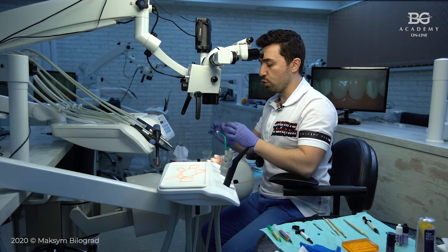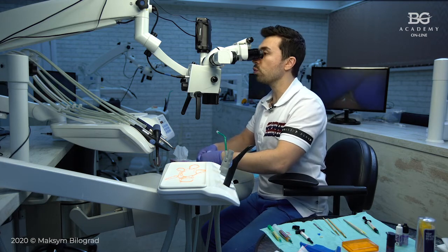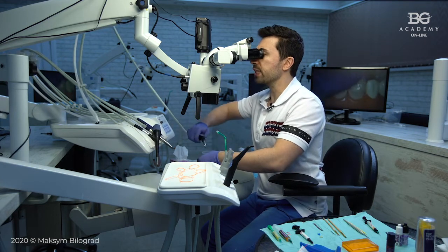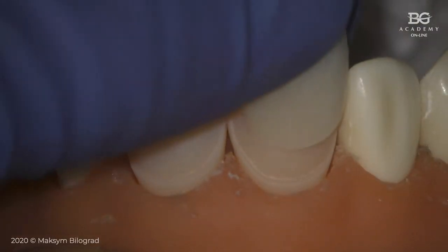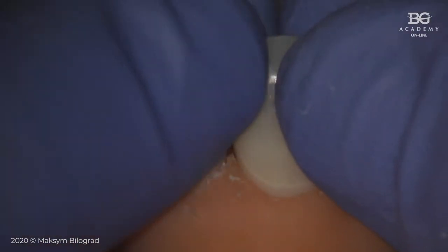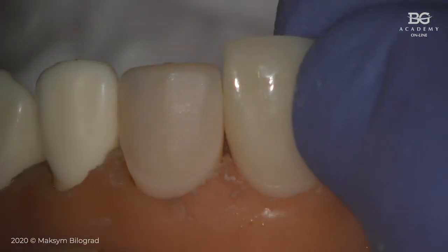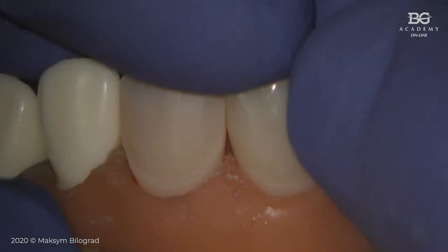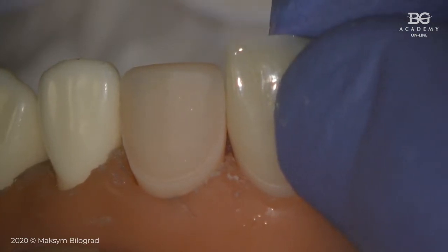Okay, so once we determine the color, if color is okay, if shape is perfect, everything is fine, we can start to make precise try-in in terms of fit. So in this case I will remove all veneers and will just keep one. I will dry the surface, and then I would like to check fit of veneer, dry fit of veneer, to be able to understand if everything is correct. Because if you have multiple veneers on teeth, you may have another problem. You may have a problem of tight interproximal contact. So in this case, we would like to avoid multiple problems.